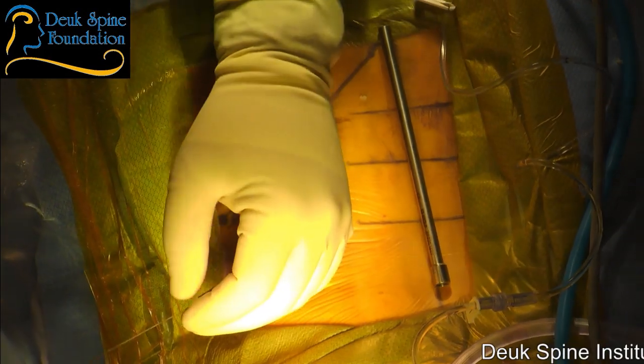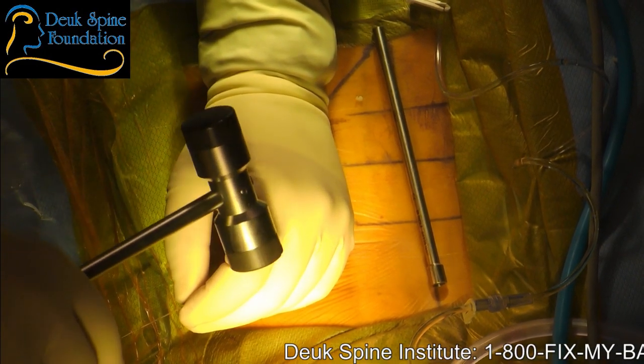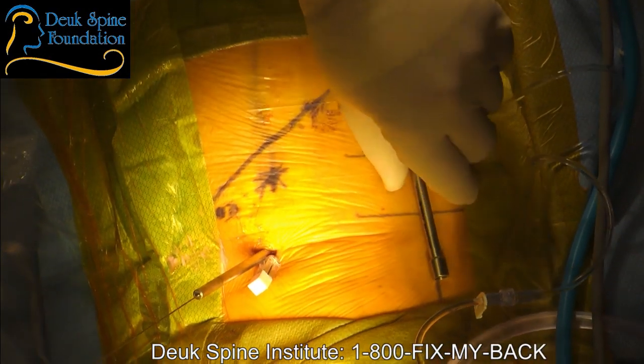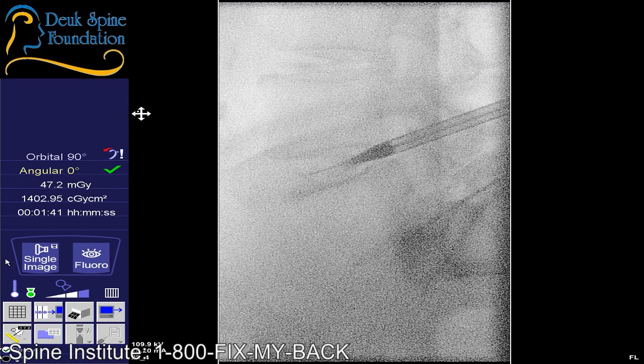looks like the guide wire is trapped. I need to see further anterior. Can you not see that? You can't lower this foam? Yeah, just a little bit. Good. All right, that's better. I don't know why we're so overexposed.